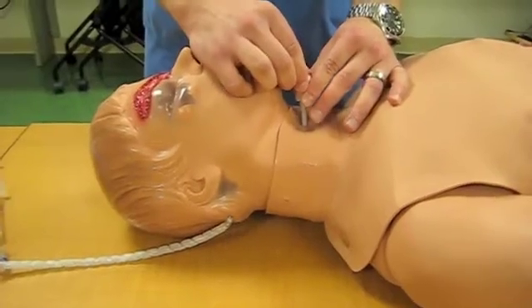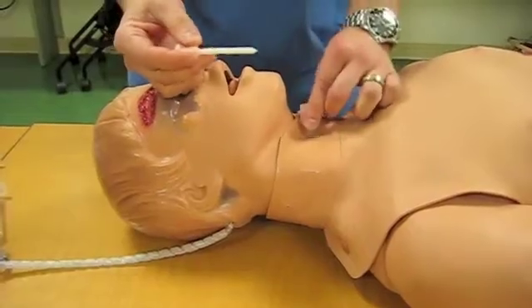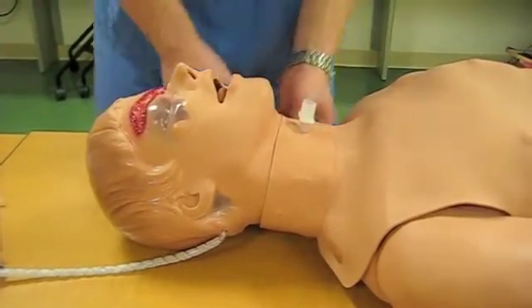When you enter the trachea, you will lose resistance until you know that you are in the trachea. At that time, you pull out the trocar and you advance the tube for successful intubation.